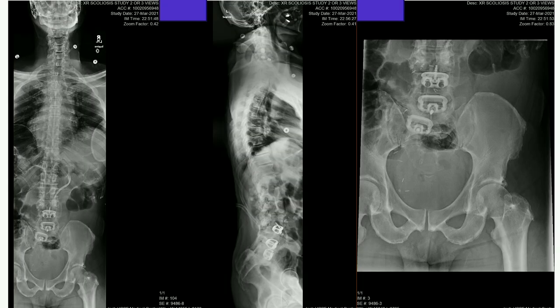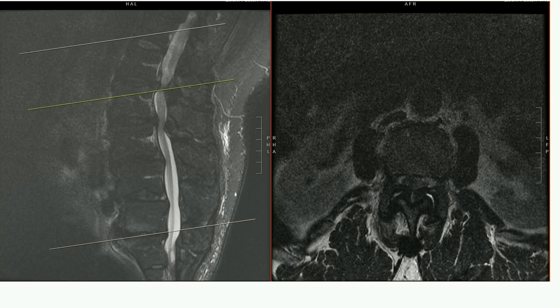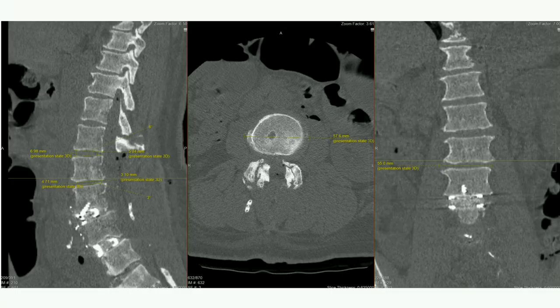He did have a little bit of stenosis. So we did a three-level ALIF after taking down the posterior fusion from L3 to L5. This is his interstage x-ray. The following day we did a prone trans-psoas approach above that — at L2-3 — and then T10 to pelvis posteriorly.